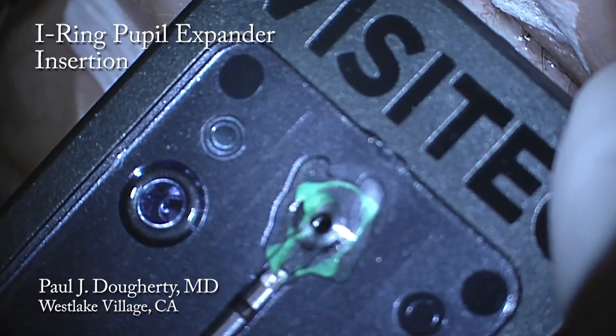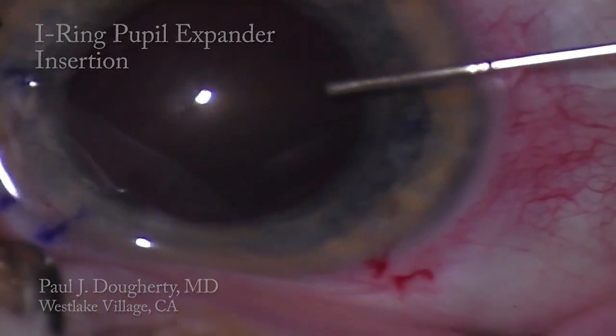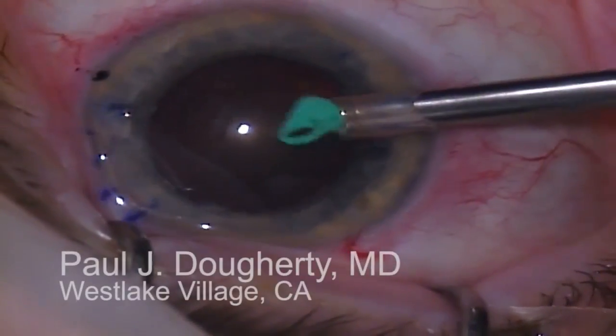This is a video of the insertion of the eye ring pupil expander from Beaver Visitec. After placing cohesive viscoelastic into the eye, I place the eye ring inserter through the 3mm incision into the anterior chamber.